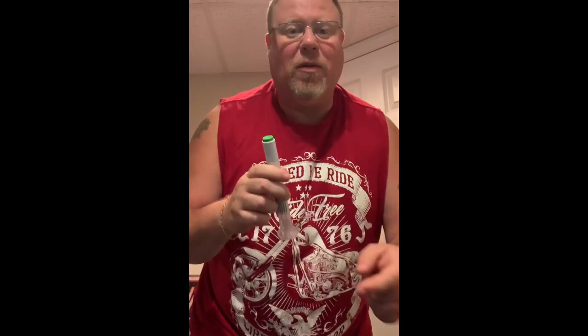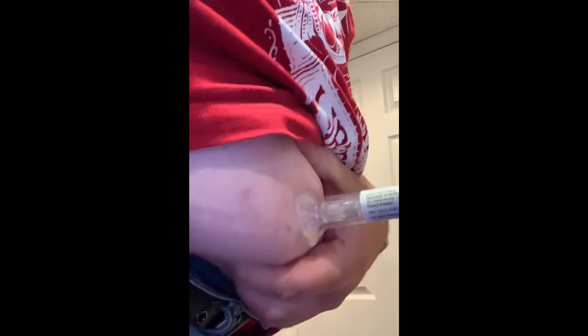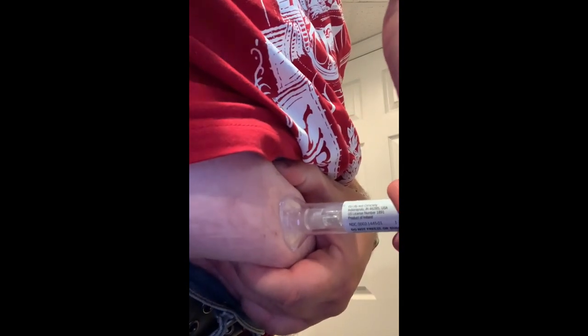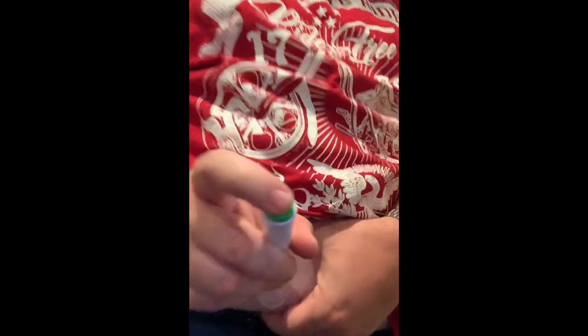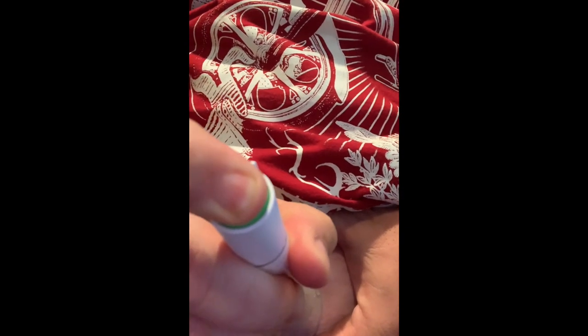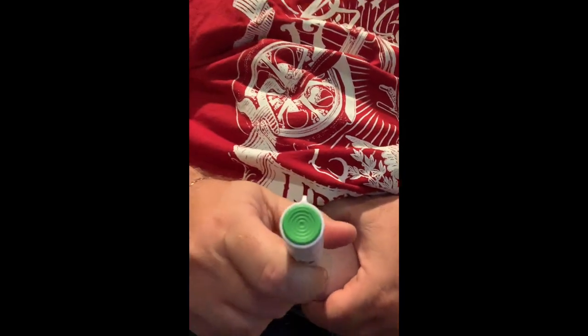Okay, it's now room temperature, so I'm ready to go. If you get squeamish, you might want to turn away. I'm going to do it on this side this time. Grab a piece of your skin, push it right up there, get your finger around the injector — and I'm pushing the button right now. You hear it clicking. I feel it, and then you hear another click. As soon as you hear that second click, you let go and pull it away.